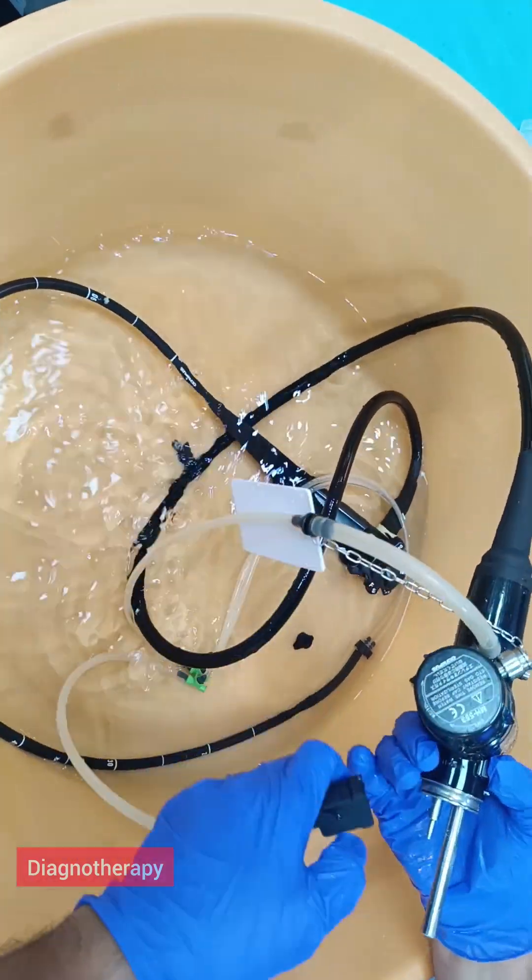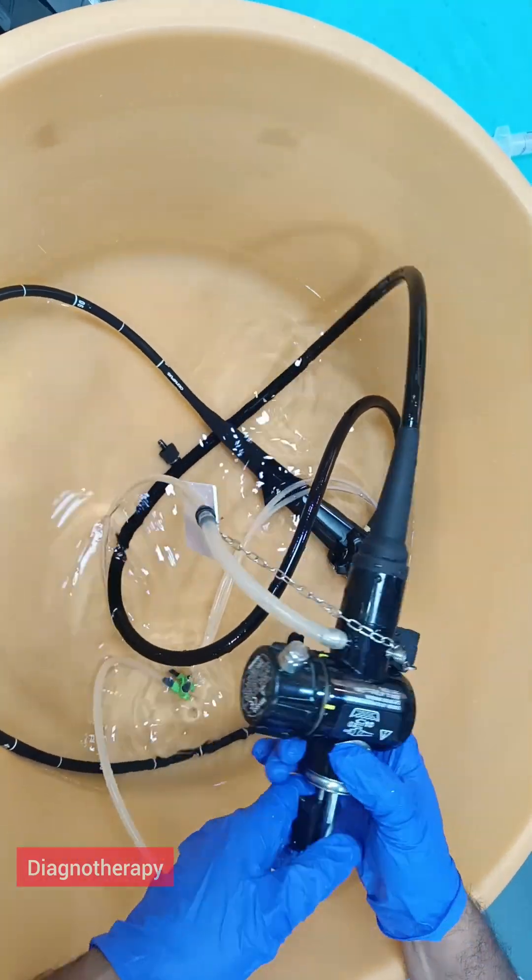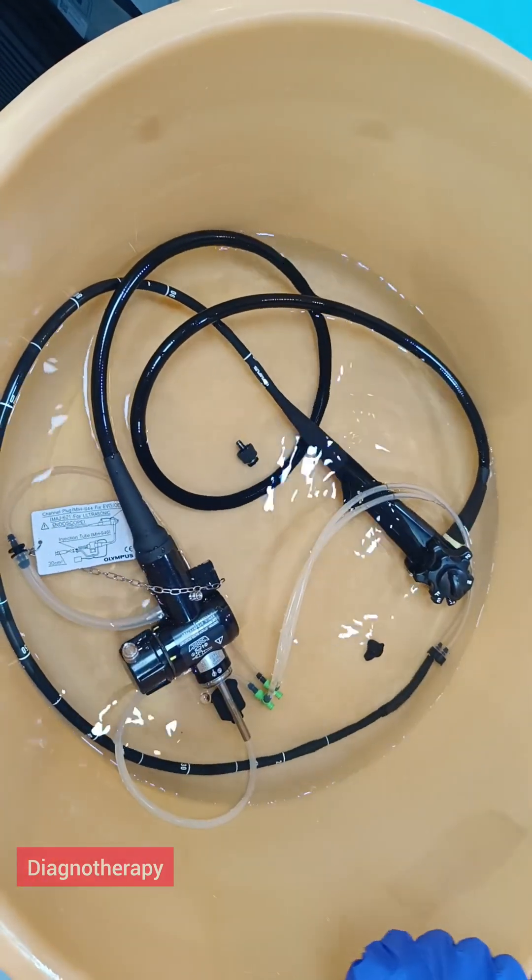Endoscopes manual cleaning through flushing. In this manual cleaning we will be flushing the scope thoroughly.